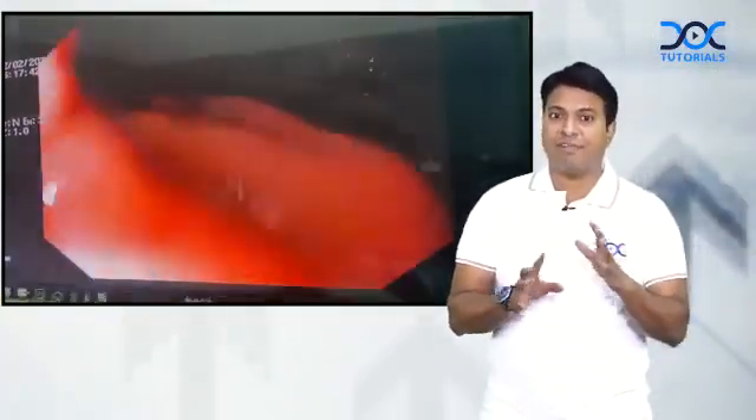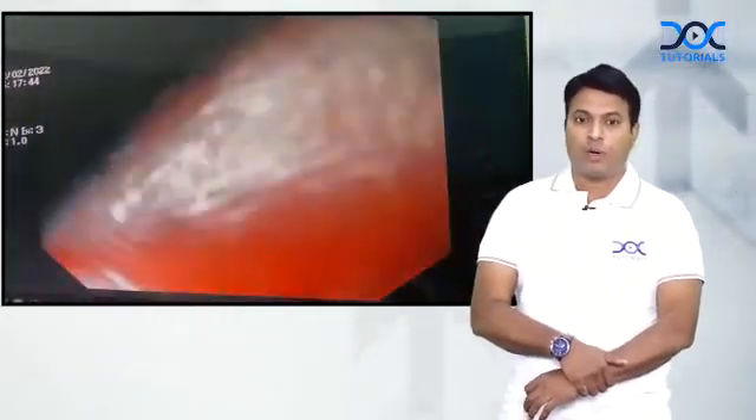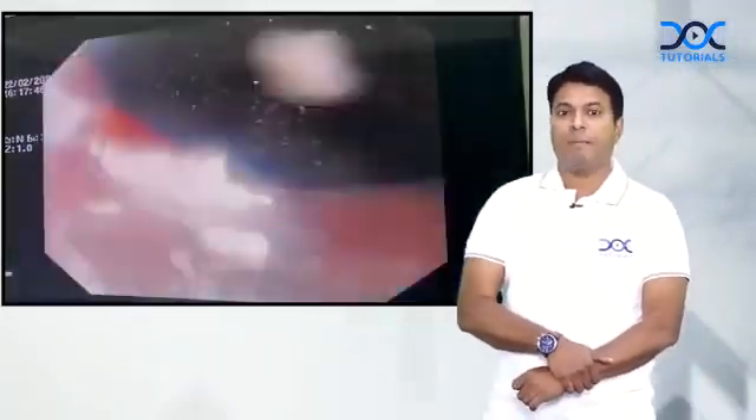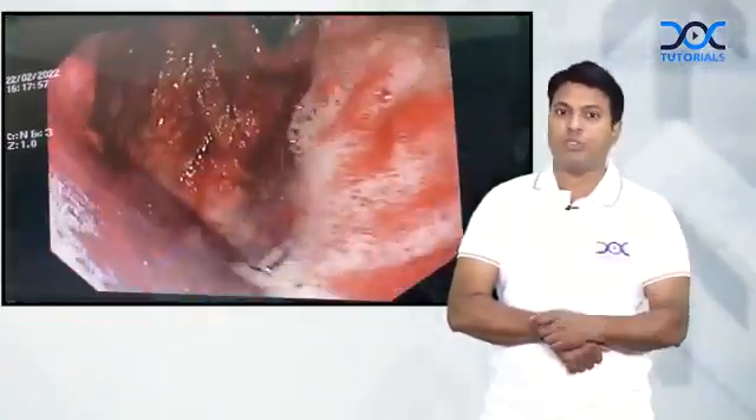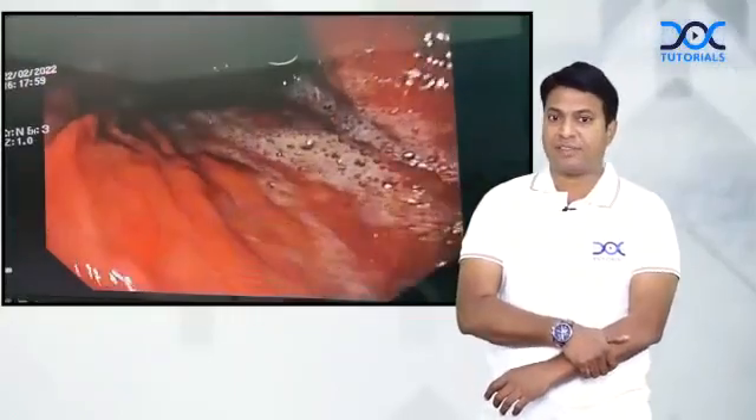I am seeing there is diffuse gastritis — everywhere there is gastritis. Here I can see the proximal OG junction, this is the incisura angularis, and you can see severe gastritis. This is a typical antral gastritis.